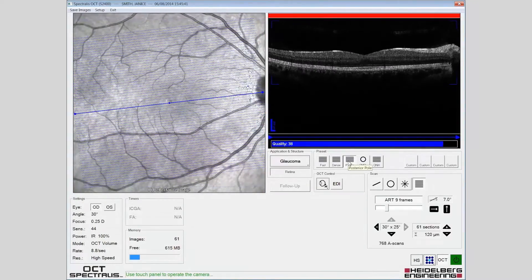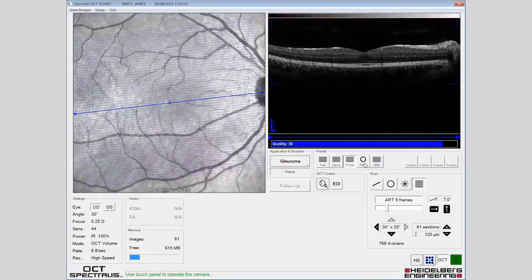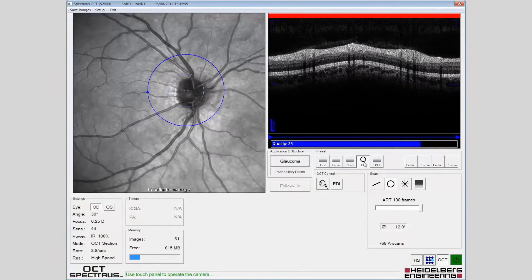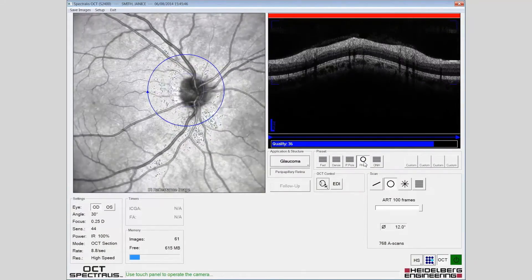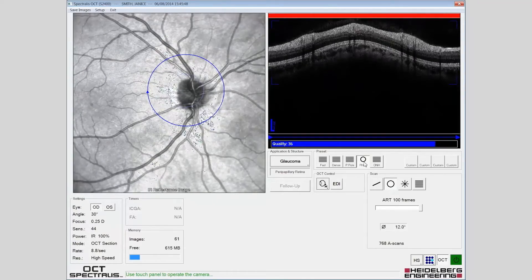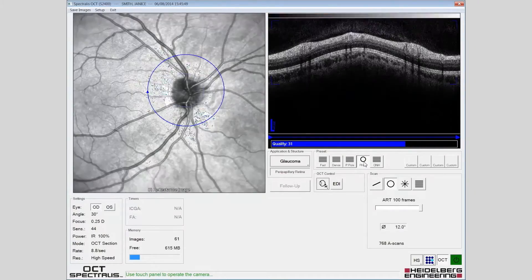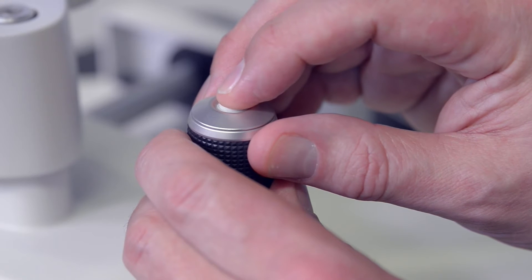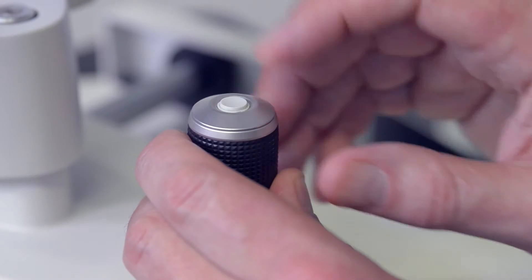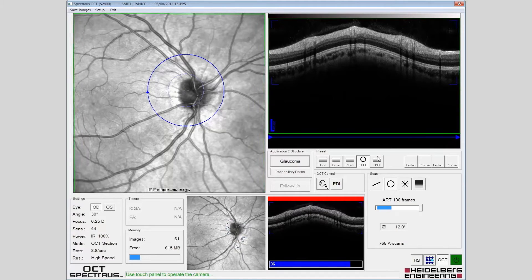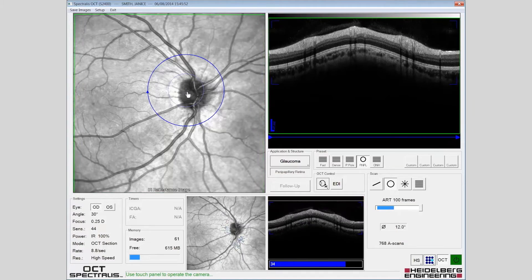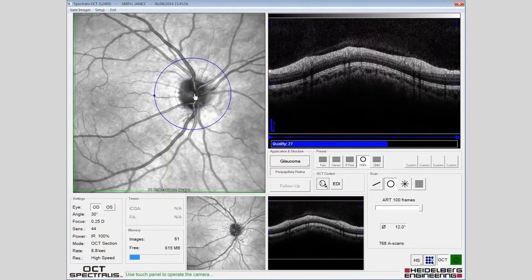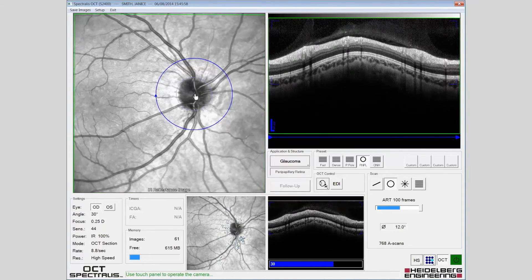Select the retinal nerve fibre scan and instruct the patient to follow the fixation target. The live eye tracking should be engaged and the scan centred on the nerve head. Image quality should be allowed to build to 100 before acquiring the image.